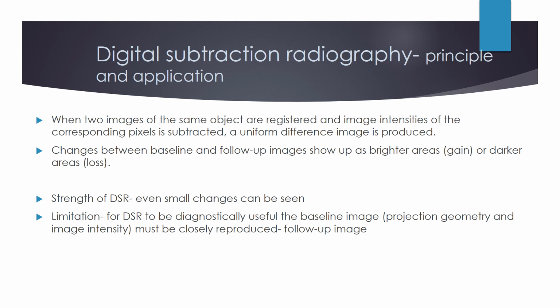Applications would be primarily in the field of periodontology or implant placement, where you are doing bone grafting and trying to visualize whether there has been a change or not.